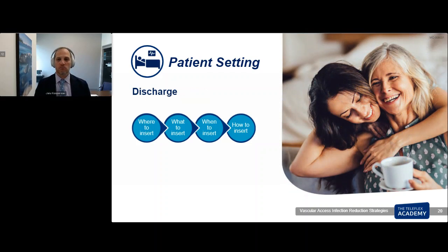At discharge, well, does anybody need to be discharged with a central line? I would say no. If somebody happens to need long-term central access, consider a port, consider a tunneled line, again, if they really need them. Because we have shown that long-term lines, like ports or tunneled central lines, have much fewer complications than short-term lines.